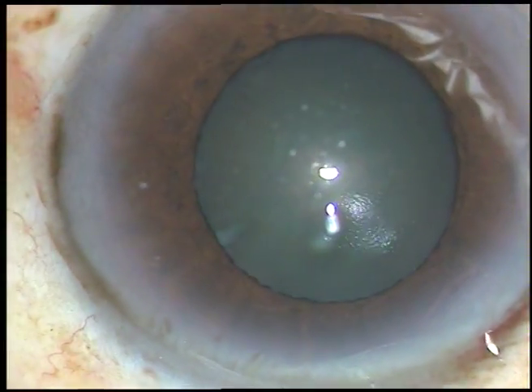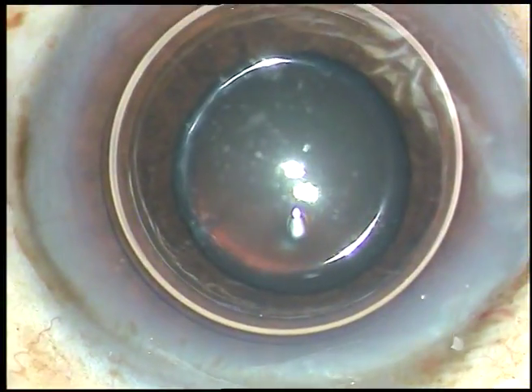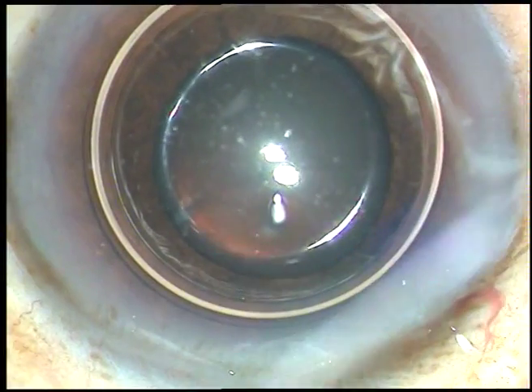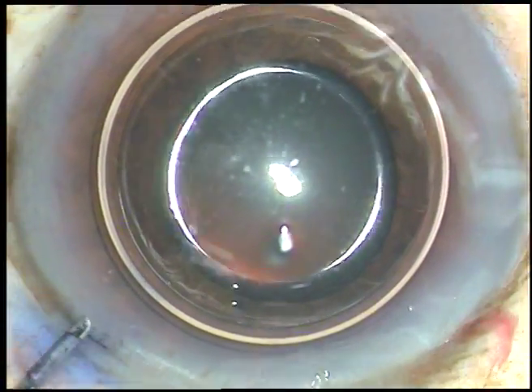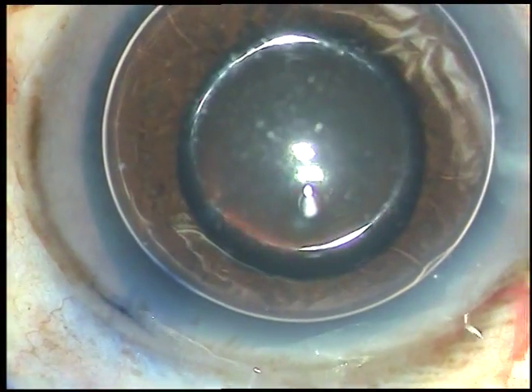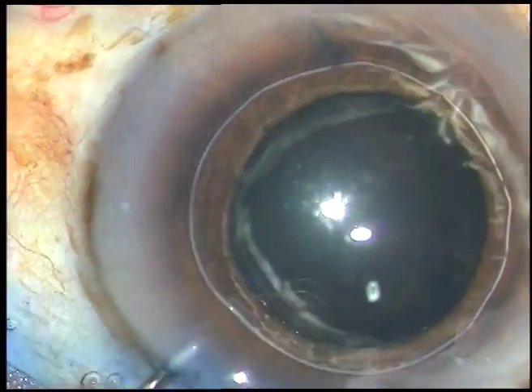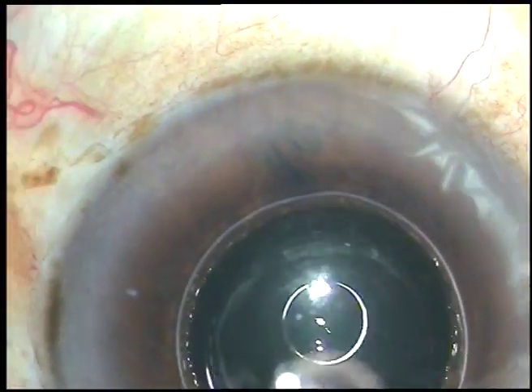By this time, the main incision and a side port on the left side of the main incision has been made. An air bubble has been injected into the anterior chamber. Now trypan blue dye is going in to stain the anterior capsule.